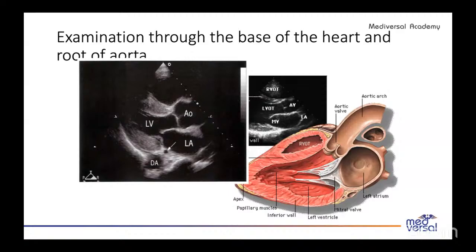In between, the interventricular septum, you have the RV, and the aorta is between the RVOT and the mitral valve. So this is the aorta. From there it goes to the aortic arch. So you see the LA, LV, and mitral valve, then the aortic valve, the RV and RVOT. So these are the structures you can see in the left parasternal long axis. Okay, next slide, please.